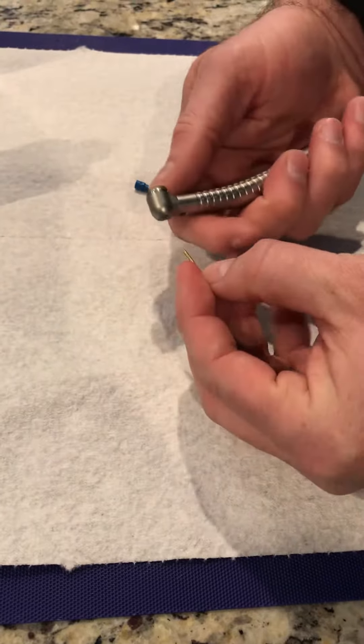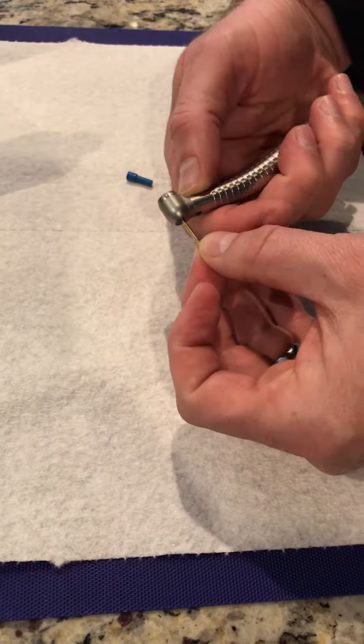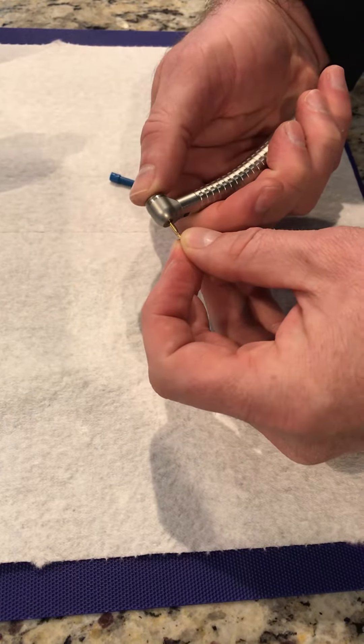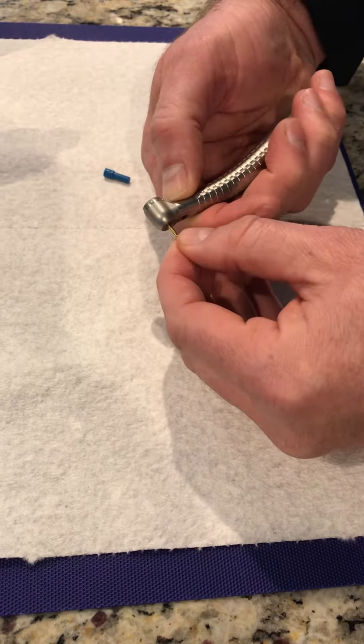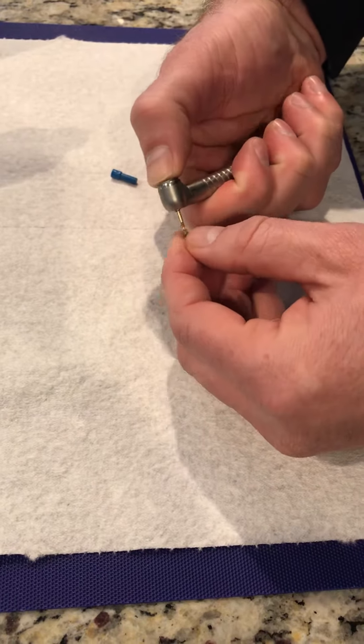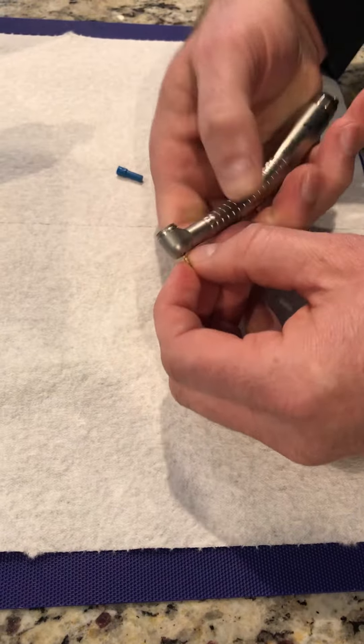One quick tip with push buttons: a lot of people will put the burr in while they press the button simultaneously. Best practice is to put the burr all the way in — bury it until it sits — then press the button hard, press it all the way in.